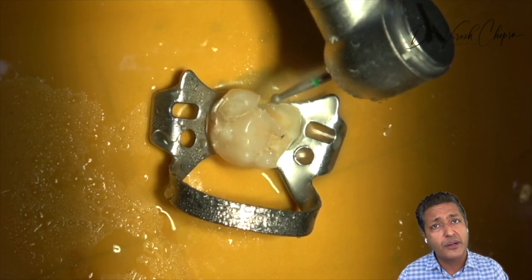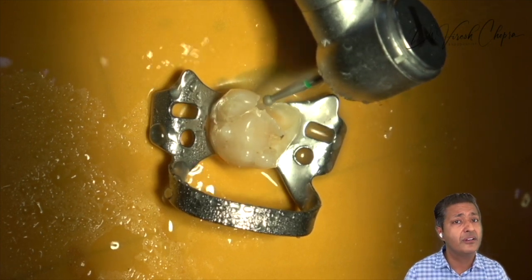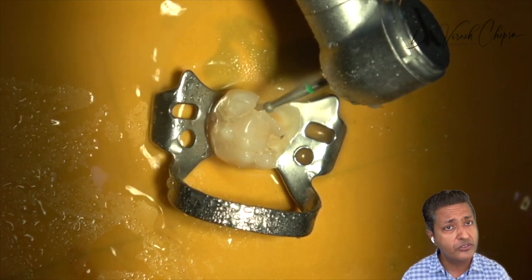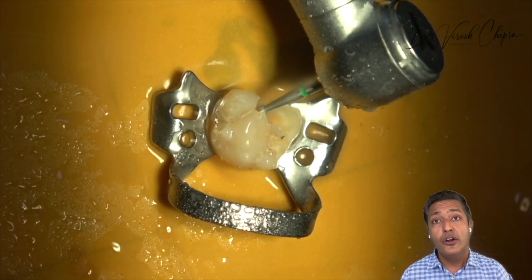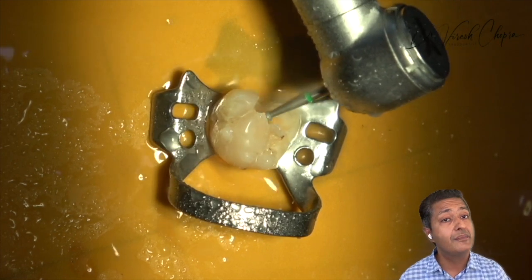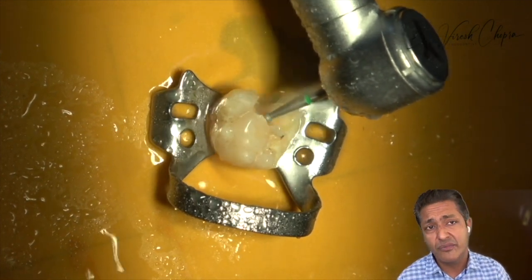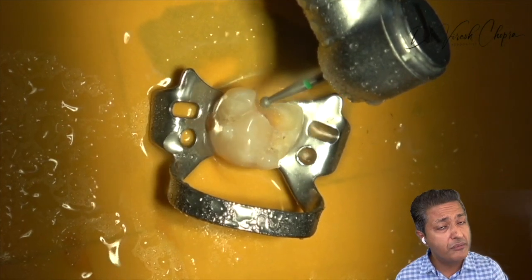Just with this brushing action, as you can see on the screen, remove the peripheral caries, remove any unsupported tooth structure, or you can say weak tooth structure, and then go ahead towards the center of the tooth. Do not leave any peripheral caries and then go towards the center and make an access cavity. We are not in a hurry because the patient is under LA, patient is under rubber dam, patient is comfortable. So we are not in a hurry to jump into the pulp chamber right now.